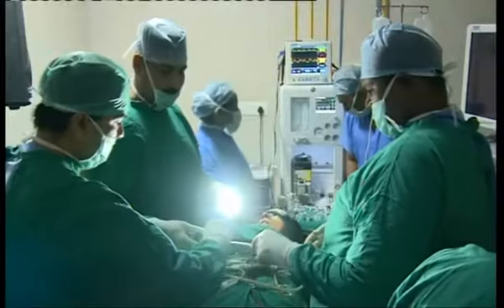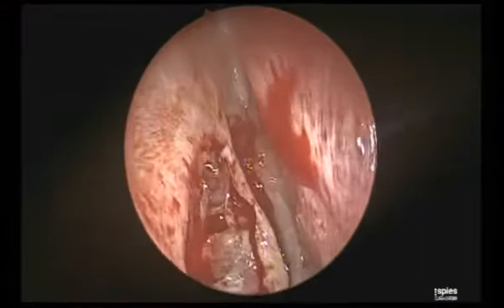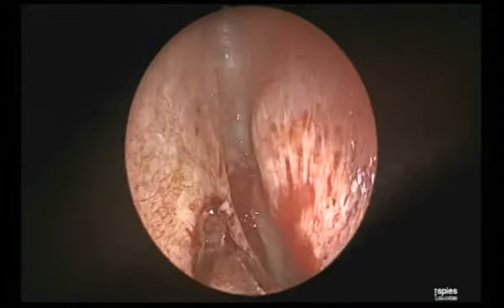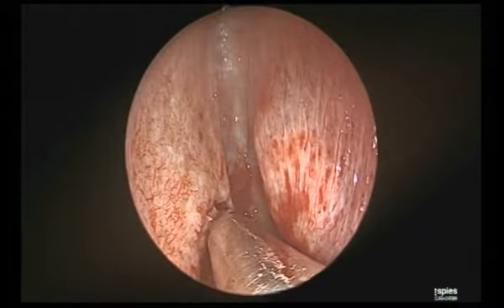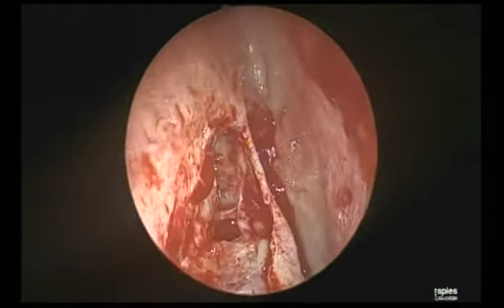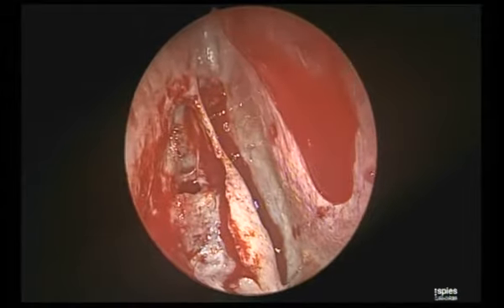Now, I will switch over to the 70 at this point to look for the frontal first, like we did on the other side. Satish, one small question. Yes, boss. Using a 3.5 mm blade or a 4 mm blade? Yes, 4 mm, sir. That's a very important question, sir. Sometimes in the frontal, in the narrow recesses, you may have to use a 3 mm blade. Okay. That's an important message. Your question is valid. Now, with the 70 degree, he was using a 3.5. This is the bulla below, can you see? Very nice, very nice.